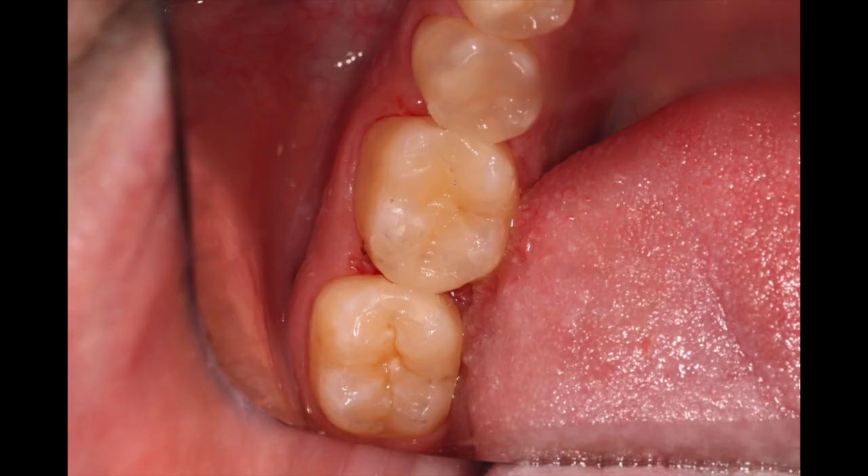Omni Chroma also says the bigger the bevel, the better it's going to blend — and that's kind of true with any composite. As you can see in these photos of a Class 5 I did on number 30, I think it came out pretty well. On this Class 3 I did — a no-prep situation on a buddy of mine — we were just testing the waters to close the black triangle he has. And on the Class 2s I did, it works really well.